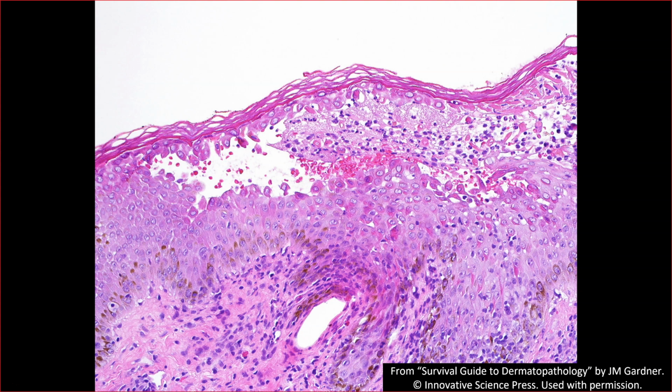So when we see it under light microscopy, there's less density to it and more light goes through. It looks pale. When the keratinocytes become acantholytic, and this is true of pemphigus vulgaris, pemphigus foliaceus, staph scalded skin, any acantholytic disease, you begin to see this rounding up in this very dense dark pink color of keratin because the keratin's all bulged up next to the nucleus. So I find that quite useful.